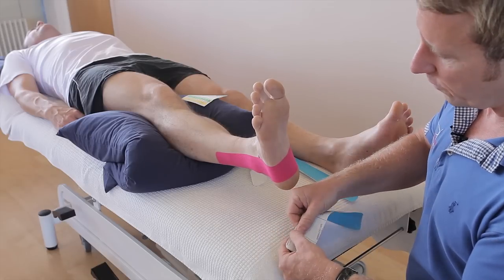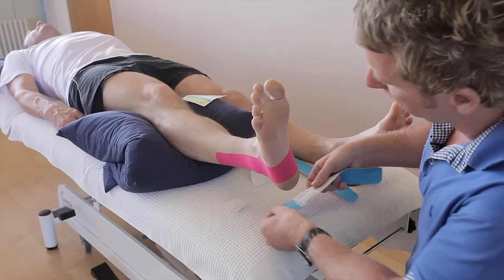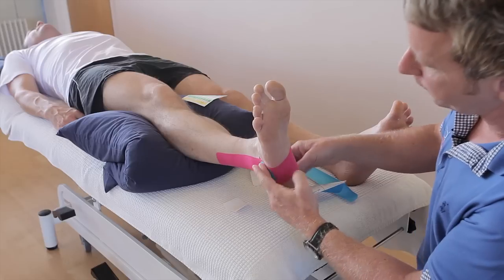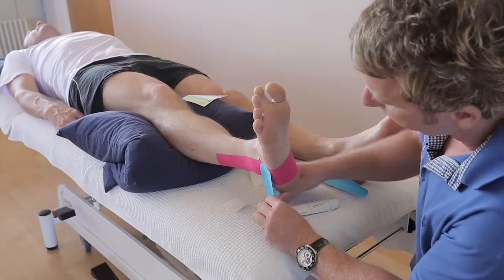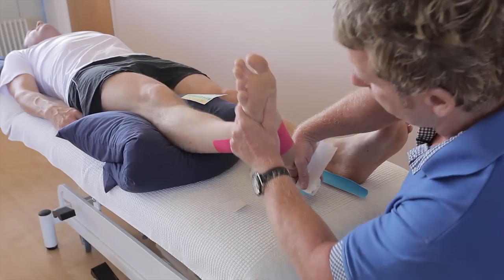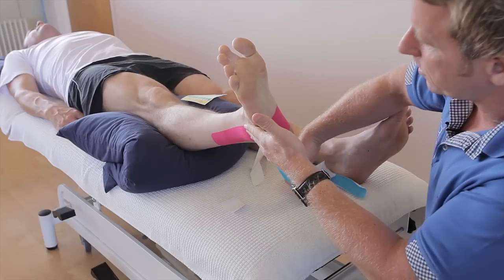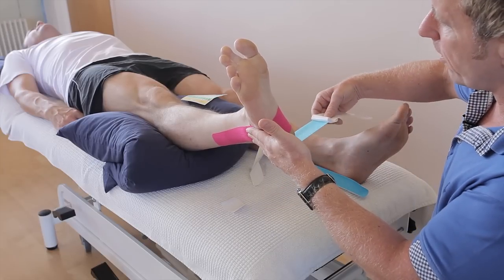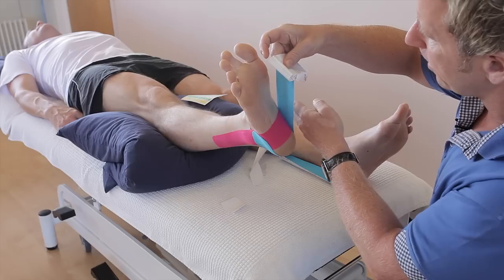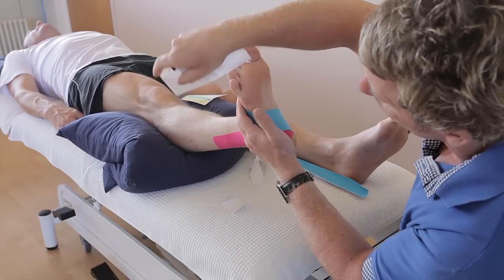Let's go to one of the squares. Apply that just inferior to the lateral malleolus — it's a little bit fiddly. Pull it so it breaks the back in, and peel it back to the end. Lock that first bit down — 50% stretch. Feed it around, so 100% back off to 50. Then as it comes around, use the back of the hand just to mold it around. And then the top bit just literally feed out with no stretch.